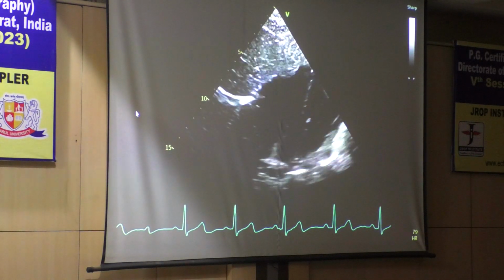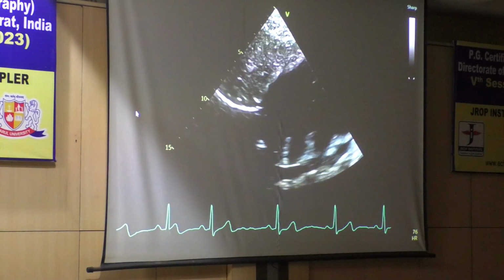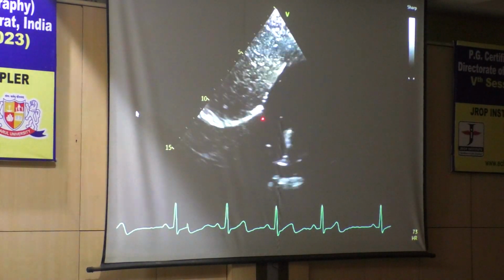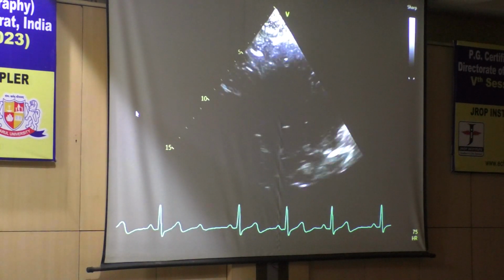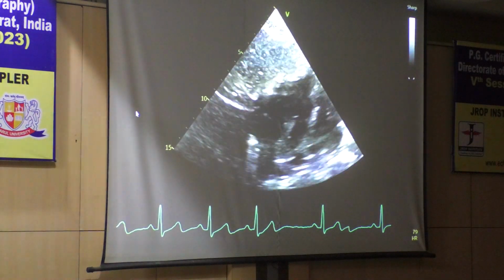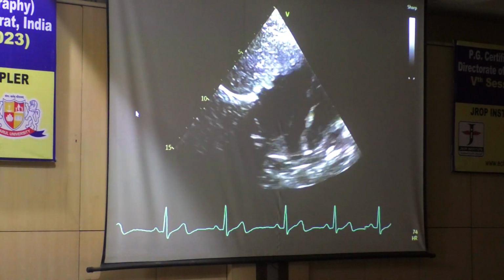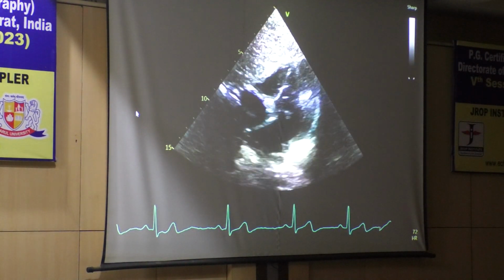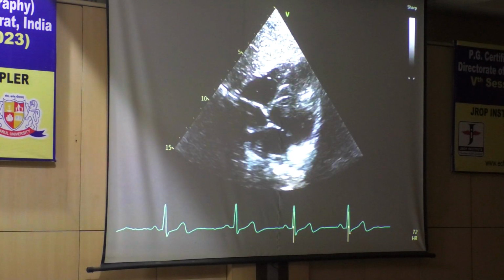And that gives a lot of strength, and we can see where my eustachian valve is. If it's there, I can't see it to a large extent. And once I see this, my image is what you have been very fond of looking at. This is what I say, the image is on the left hand side.